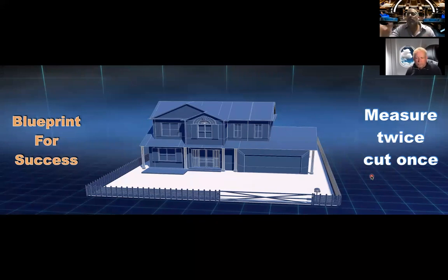And we can do that in a freehand approach. We can do it in a template assisted approach where we use maybe some kind of a stent to help guide us in place, or we can use a static guide or a virtual dynamic guide.